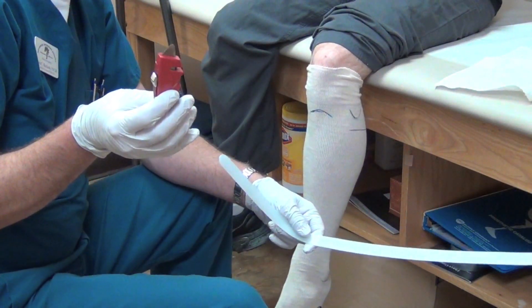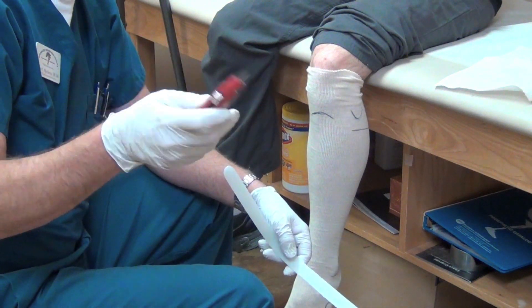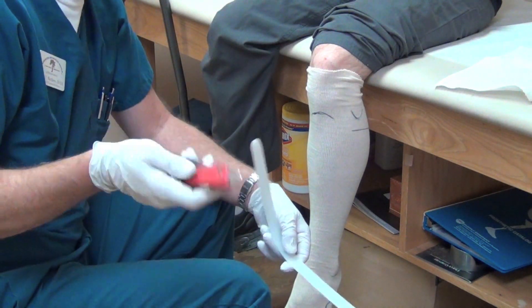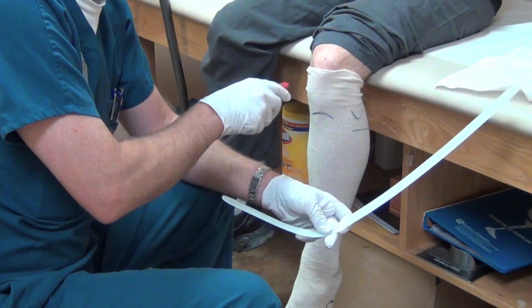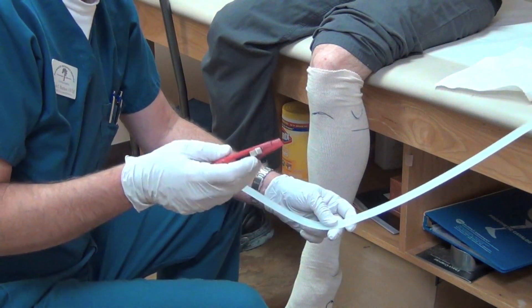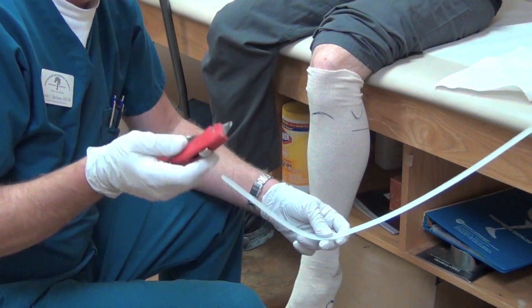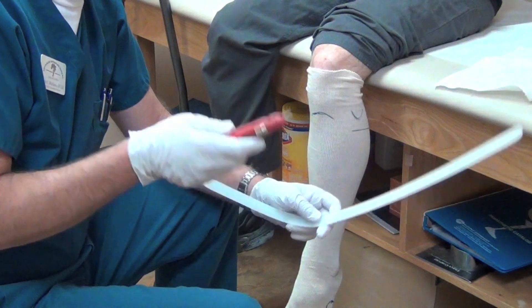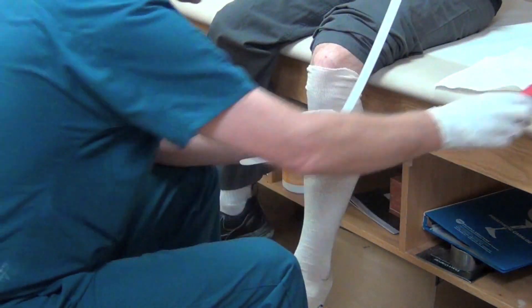For removing the cast, I use a utility knife blade that I dull on the sander — I go back on my fine sandpaper, round it, and then sharpen it with the sandpaper, which in fact dulls it, so that if I do miss the plastic it'll just be a scratch unless I'm pushing really hard, which I tend not to do. I've been doing this 30 years. This is my favorite technique because it's the simplest. I've never missed and hit someone, and I really highlight and mark my cutting strip so I know exactly where it is. Make sure that you cut it off before your cast sets up — if your cast sets up completely, you may need a cast saw.